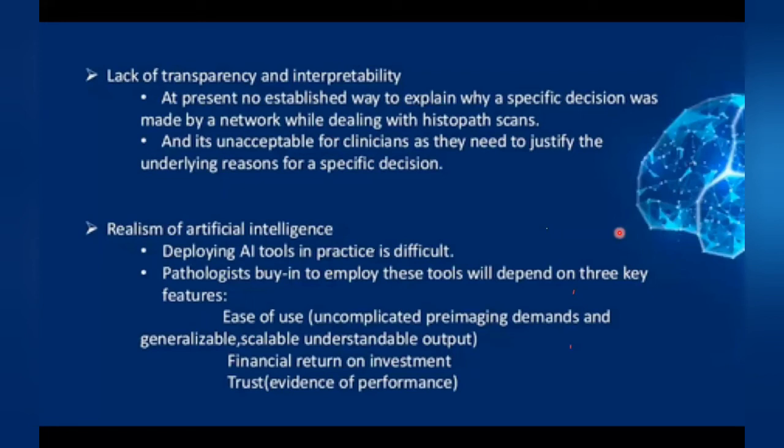So I think the pathologists will take these decisions, key features to look into before they deploy. One is the ease of use. They should be able to use it very easily. I can tell you the ER, PR and Ki-67 algorithms have become so easy. You just put the slide in, mark the area, and it does the calculation and gives it to you.